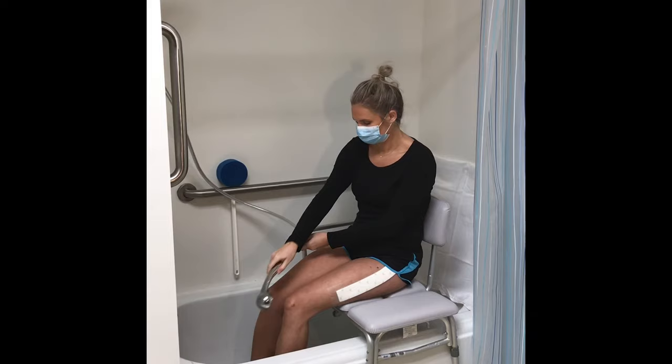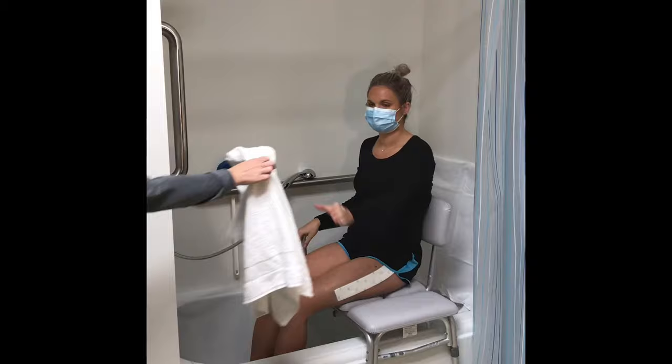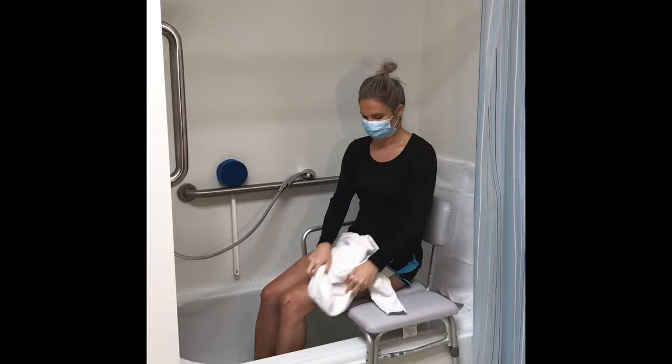Let soap and water run over your incision and bandage — no scrubbing. Before getting out of the tub, dry off as much as possible while sitting down. Pat the incision and bandage dry.